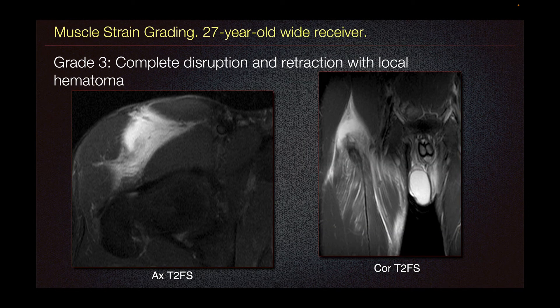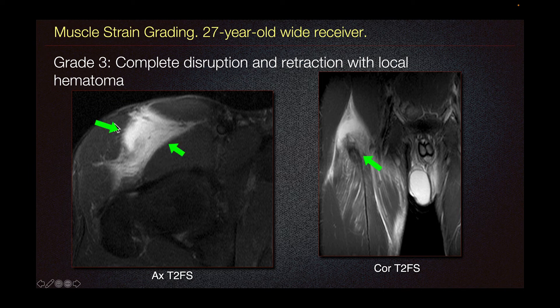This is a different patient, a 27-year-old wide receiver. Grade 3 strain is characterized by complete disruption and retraction of the fibers with local hematoma. On axial T2 fat sat imaging, we can see this hematoma. On our coronal T2 fat sat imaging, we can see these torn fibers, which are retracted distally. In the proximal aspect, we can see the hematoma and surrounding edema about the rectus femoris.